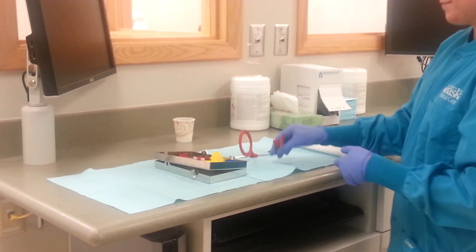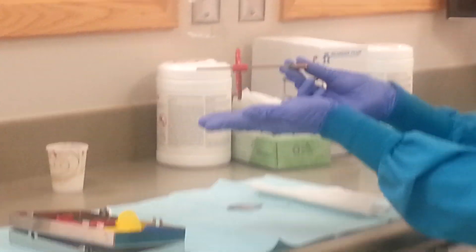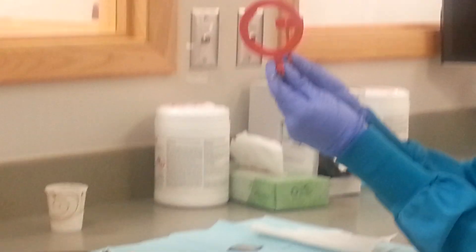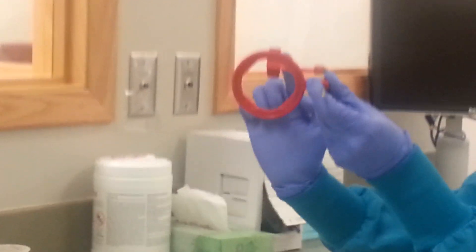For molar bitewings, you will use the XCP rod that is straight. Next, connect the horizontal bite block. Finally, attach the positioning ring so that it is not offset. Ensure it is the correct one by looking through the ring and making sure it lines up with the bite block centered.